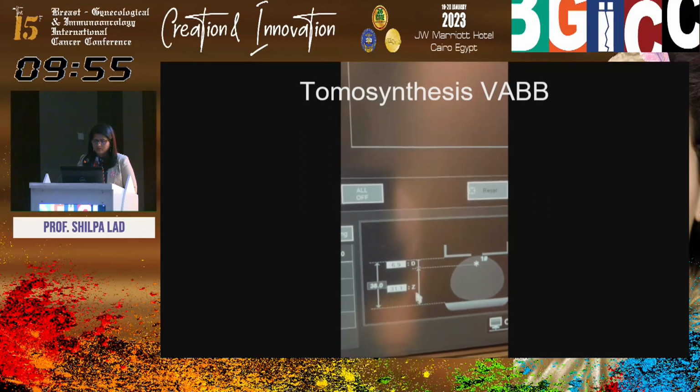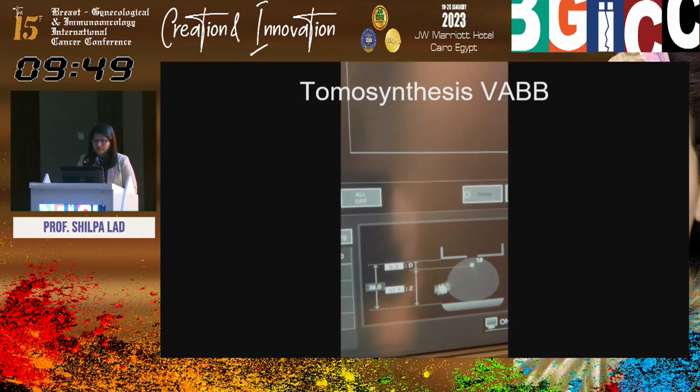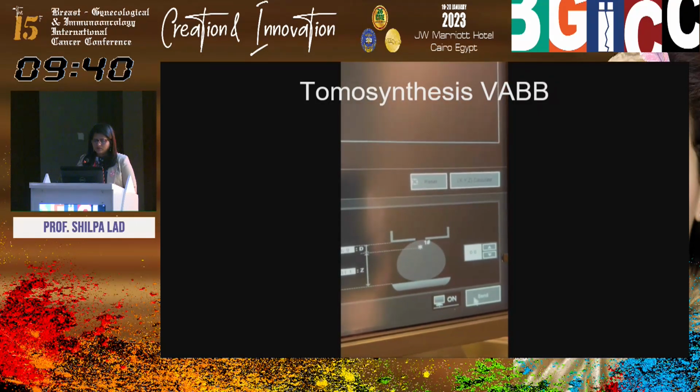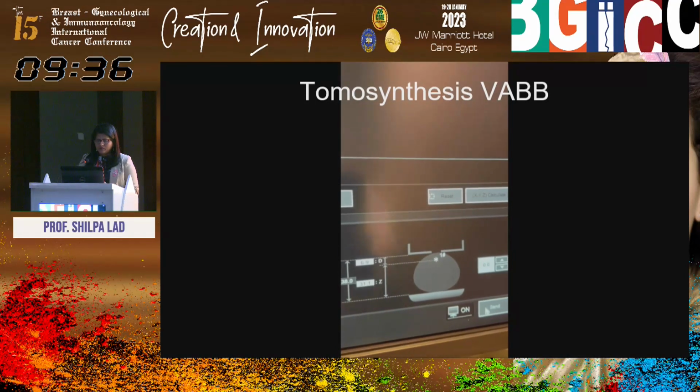Okay, and this is our Z, which is the depth. The X and Y has already been coordinated. The depth that we need to go is 31.1 millimeters. So once we say send on this screen, we get the target on the machine.